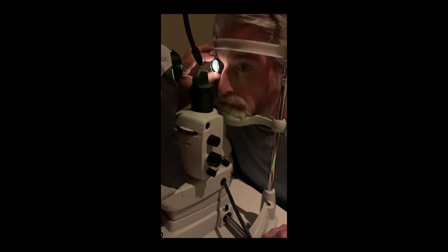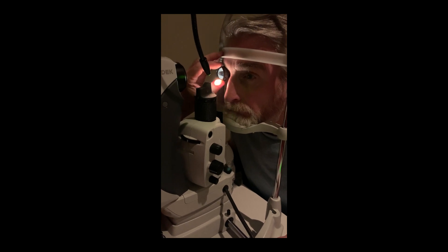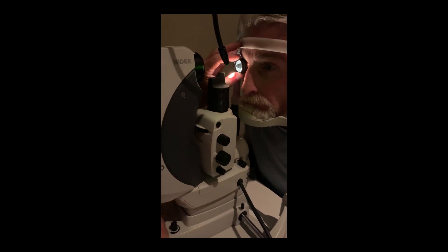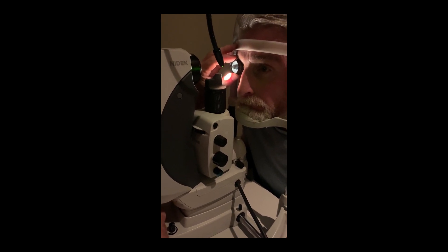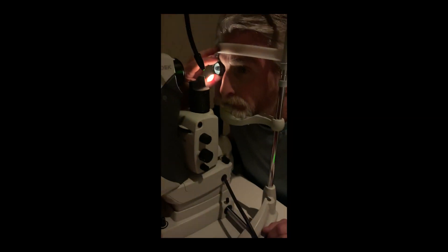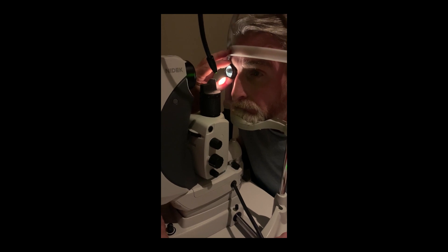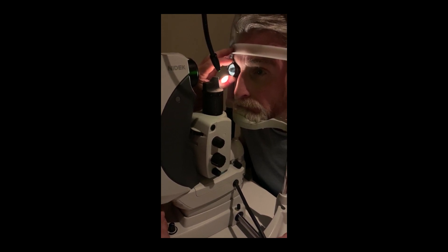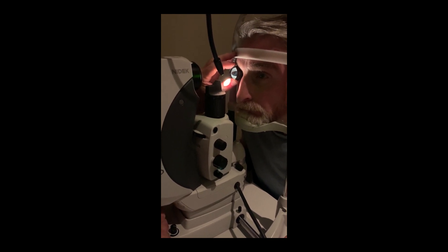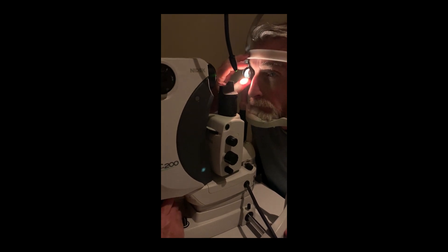I'd also like better control of the energy settings, and on this laser I have excellent control of those settings. Optics are important because we want excellent visualization when we treat, and in my experience the optics on this laser are comparable to my slit lamps — simply excellent. I also have an adjustable illumination tower that can go up and down based on what I need. Finally, the laser has been ergonomically redesigned, so it's comfortable and has a shorter operating distance, which makes treatments much easier.